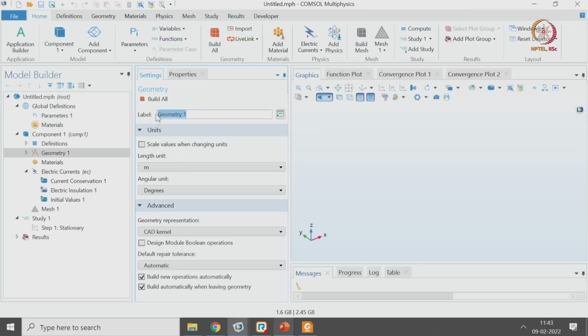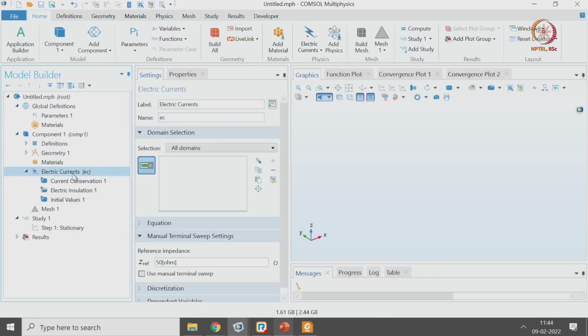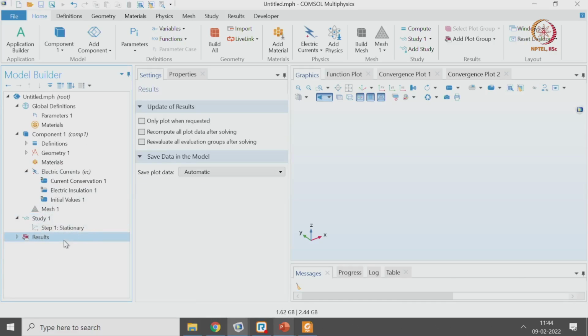So that's it. Now I come to the main interface of COMSOL Multiphysics. What you see on the left side is the Model Builder, and the approach in the Model Builder is from top to bottom. First you make the geometry, then you add the materials, then you apply appropriate physics conditions, then you mesh the geometry, and then you perform an analysis, be it a stationary, frequency domain or time domain analysis, and finally you post process the results. So the approach in the Model Builder section is from top to bottom.